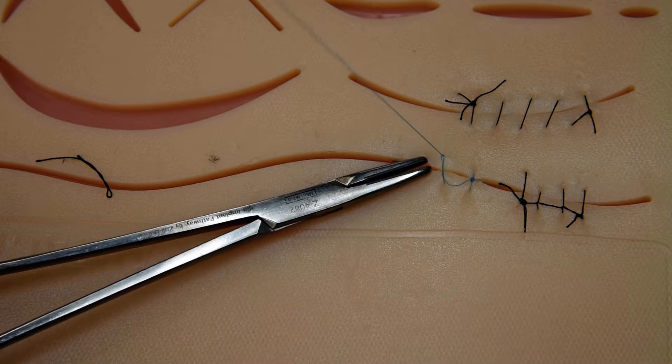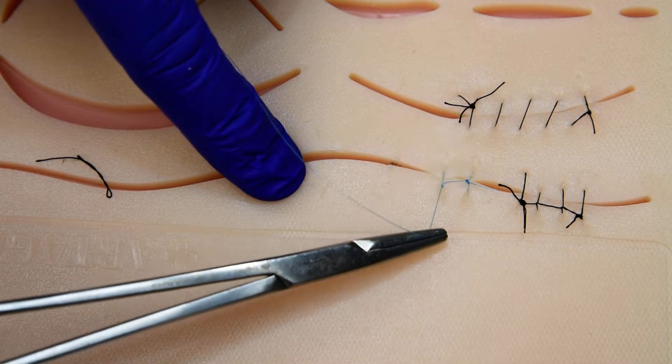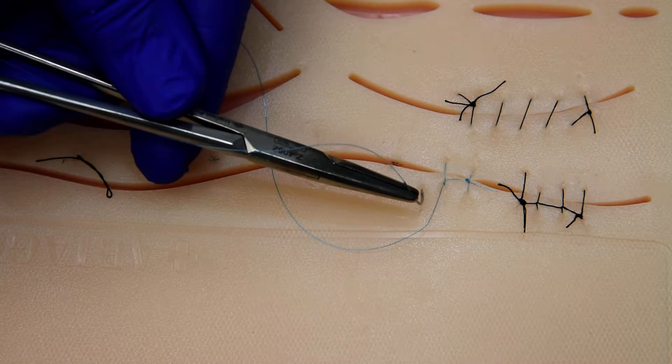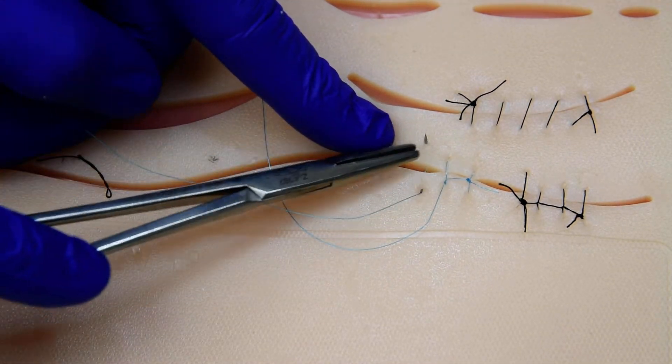As we cinch it close, grab it and rock it across the incision and lock it to the buckle. The knot, because of the double interlocking, holds a little bit tighter. Really useful with PTFE sutures or nylon or something to this effect.